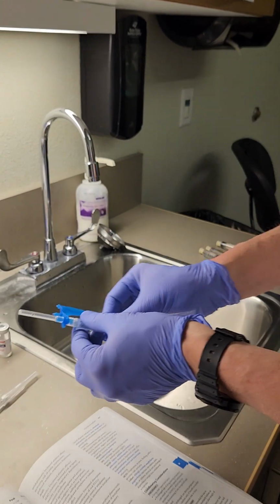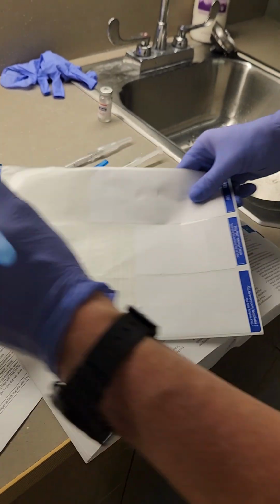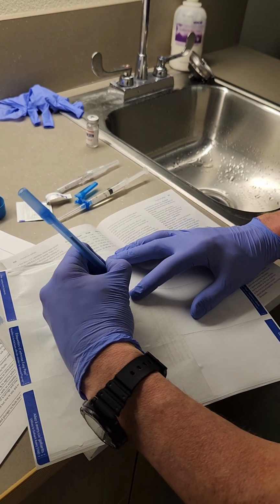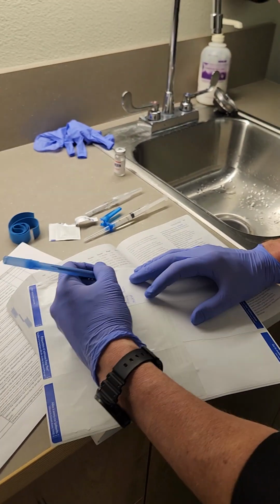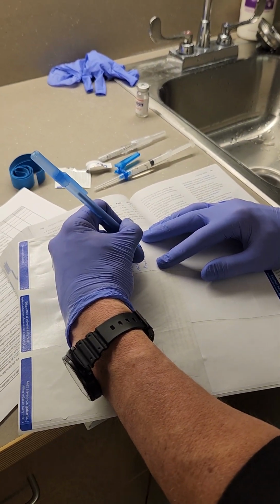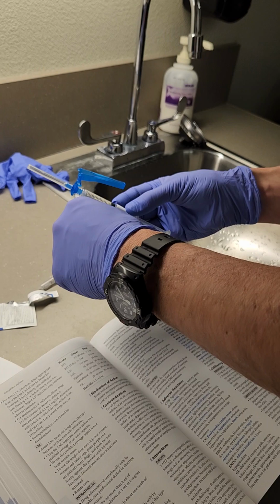And when I get there, I also want to, let's see, I would say Minnie Mouse. Let's see what her MAR number is and what the, let's see, morphine, 2 milliliters. Okay. I'll go ahead and label that like so.